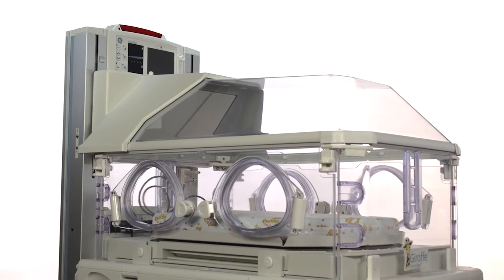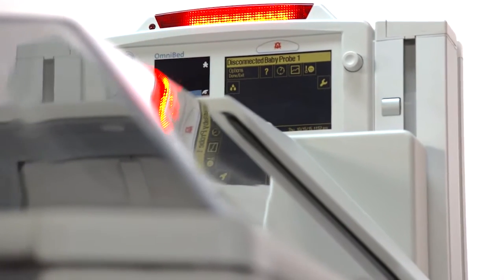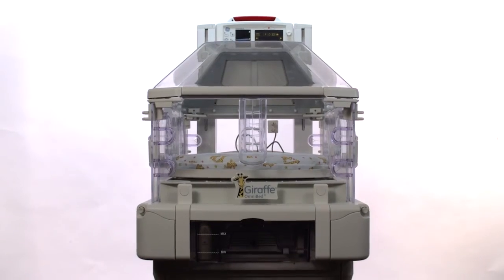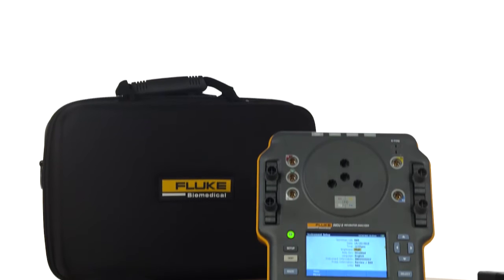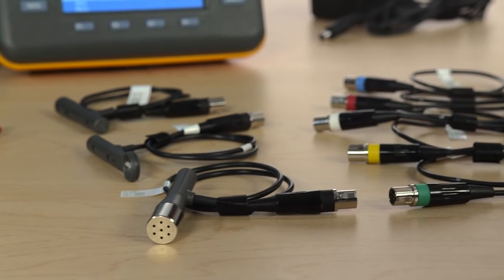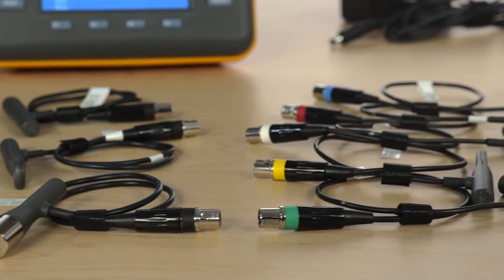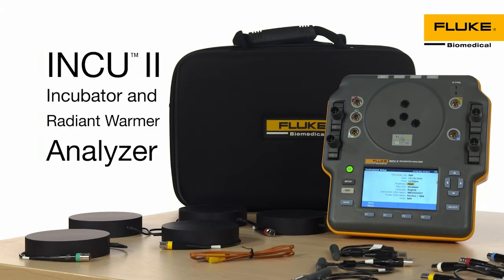Your smallest patients can be your most vulnerable, which is why it's essential you regularly test the performance and safety of your facility's neonatal incubators and radiant warmers. Fluke Biomedical would like to introduce you to the INCU II Infant Incubator and Radiant Warmer Analyzer. The INCU II is the only all-in-one portable and easy-to-use analyzer that complies with IEC 60601-2-19, 2-20, and 2-21 standards.